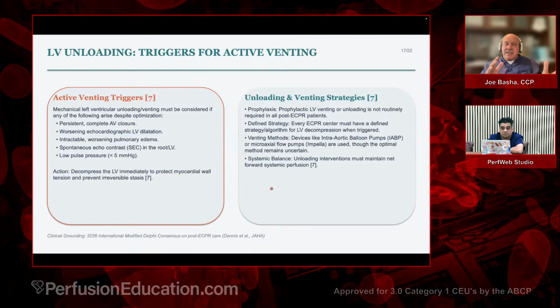So keep in mind, as you dilate that LV and put it under pressure, your LV chamber is under pressure. Its ability to perfuse the myocardium normally is obstructed because of the natural flow patterns of your vascular anatomy, right? So that's a real problem. The microcirculation of your LV, or your heart in general, will not be perfused. It will take the path of least resistance. Prophylactic LV venting or unloading is not routinely required in all post-ECPR patients.